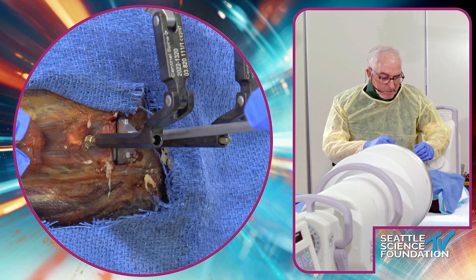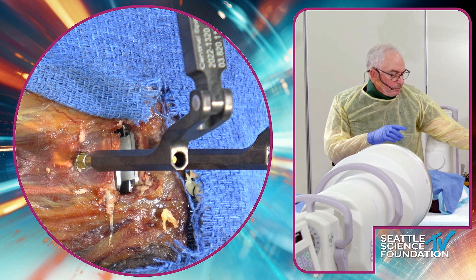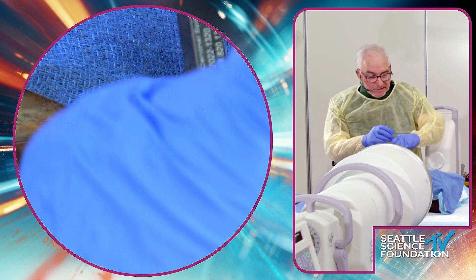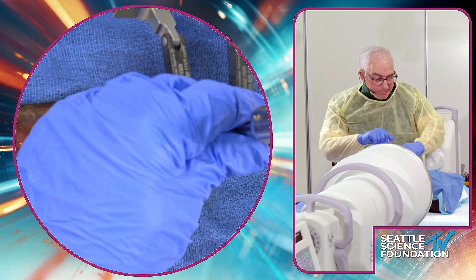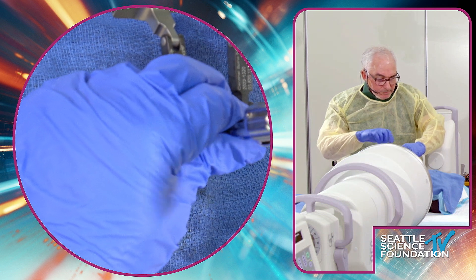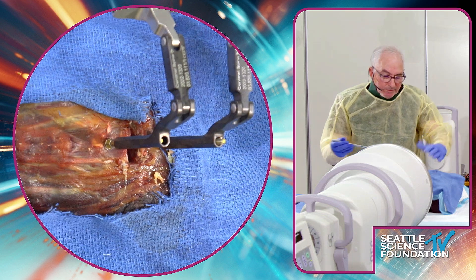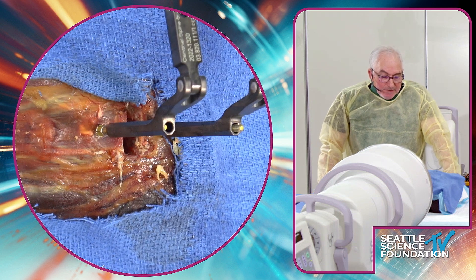If we can get the inserter back in, that's one approach. For certain discs that have mechanically failed, you can just take them out piecemeal — usually it's easier to get the poly out first. I'm not going to ruin this disc since they were nice enough to give it to us, so I'll put the inserter back on. Because we've distracted, we're done with the removal.